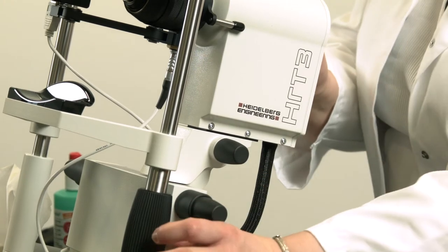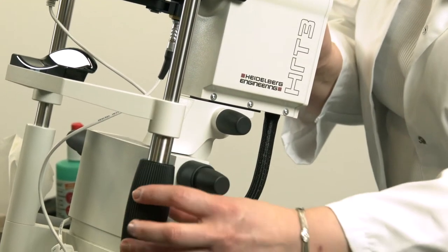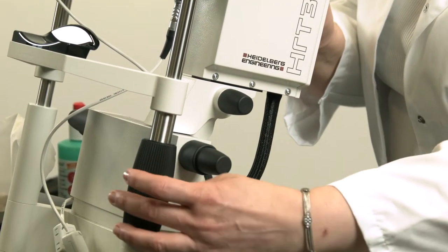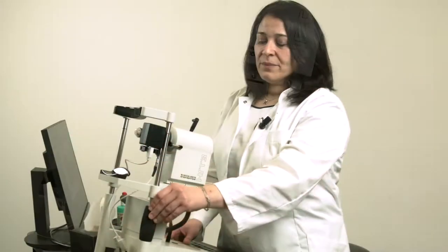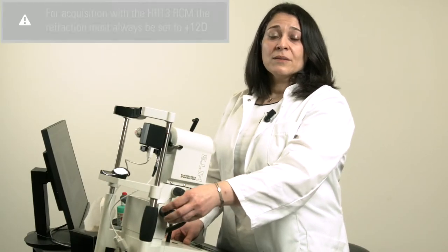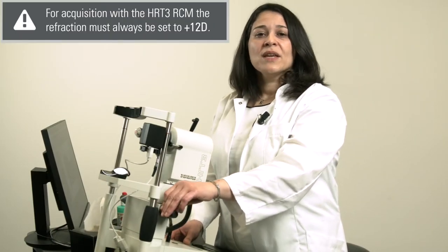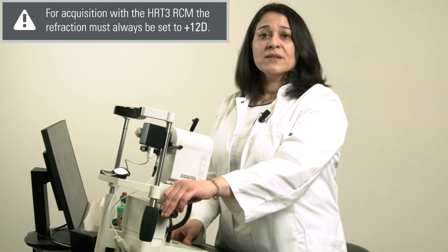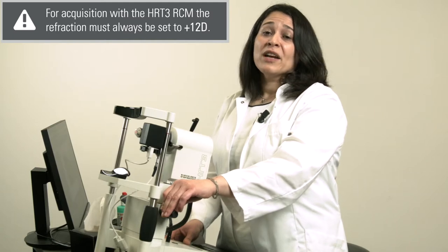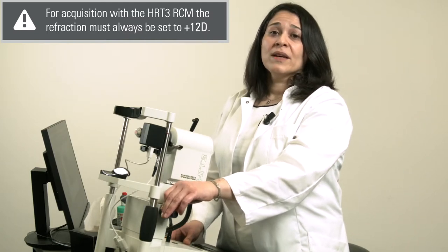The chin rest is adjusted with a screw on the chin rest guide. The focus can be adjusted on the lens. Please note that for acquisition of the HRT3 RCM, the refraction must always be set to plus 12 diopters.